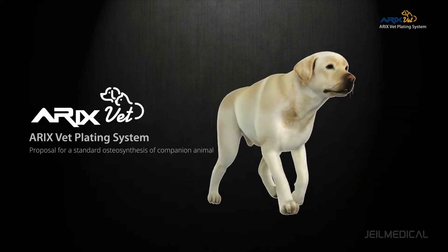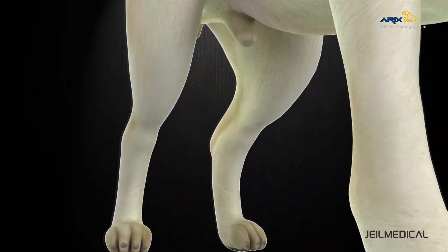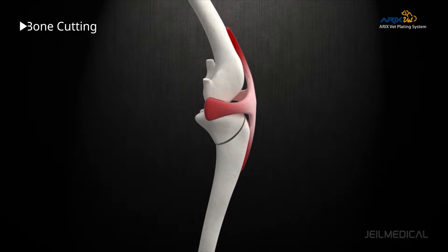ARIX Vet is a veterinary product brand of Jeil Medical Corporation for Animal Care. The TPLO plate is designed for the surgery of tibia plateau leveling osteotomy, which is treated for the rupture of anterior cruciate ligament.